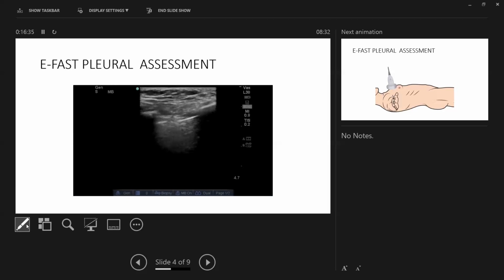So you see lung sliding appear and disappear. This is at the very edge of the pneumothorax, where the area of the lung is moving into view. This tells you that there is a little bit of depth about how it is, but the most important thing to take away from there is what you call it, the sliding versus no sliding. Right? So if you can see pleural sliding, it's quite easy after a while.